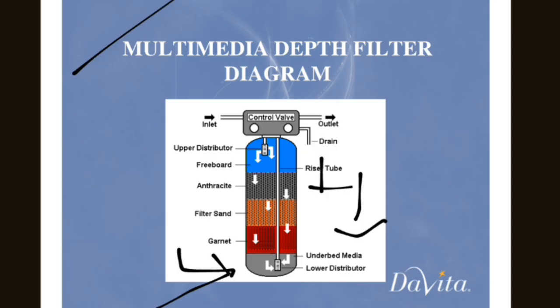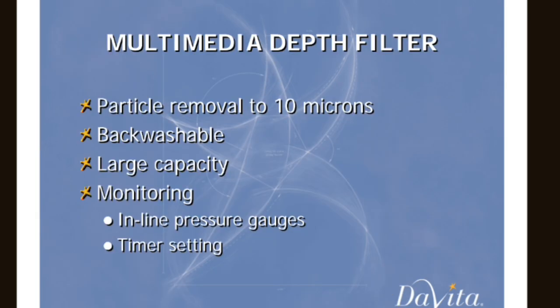After that the purified water goes back to the top and proceeds to our second tank. Here are the principles of the multimedia filter.